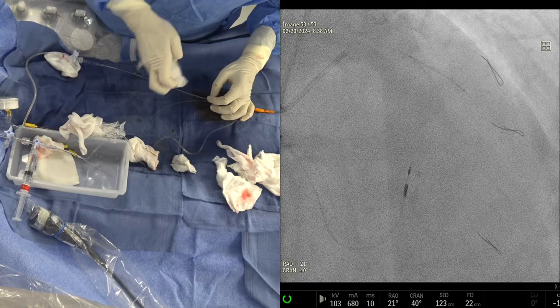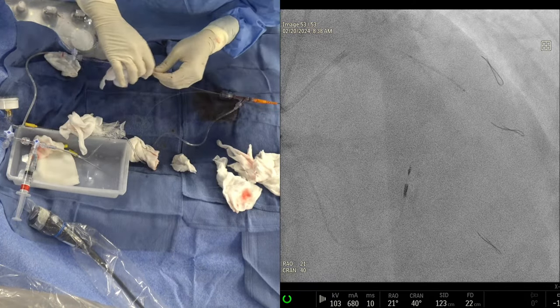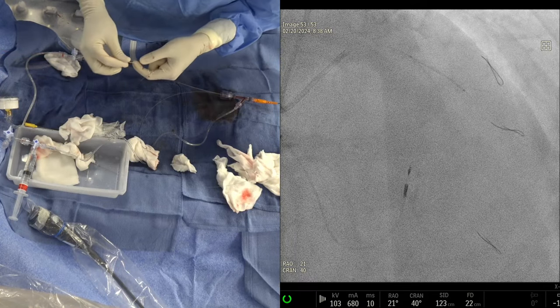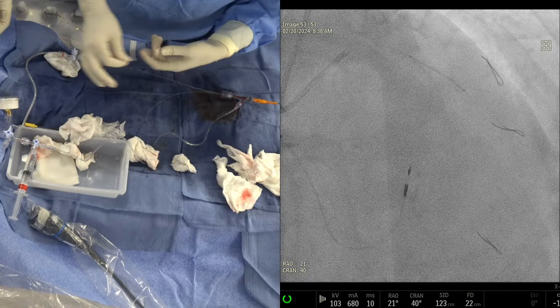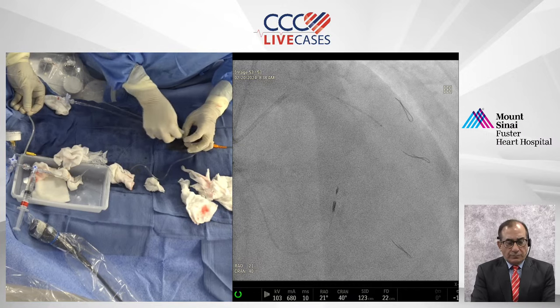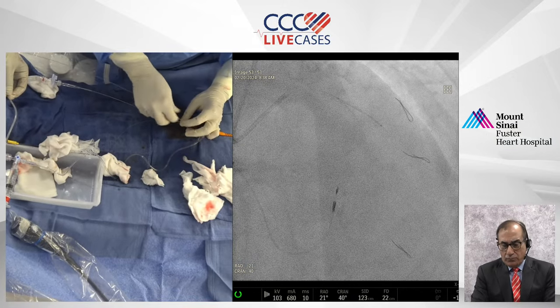The cutting balloon for D1 was the same 2.5, no? Yeah, but it did not cross. Then we just did a high-pressure balloon. The 2.75 by 12 high-pressure balloon we did. So now we are going with a 38 length in the LAD, because we have to cover both the diagonals and the mid-LAD lesion, after the septal. Because you have to have full coverage. We will not deploy the D1 stent, LAD stent yet. Till the wire. We do, yeah.